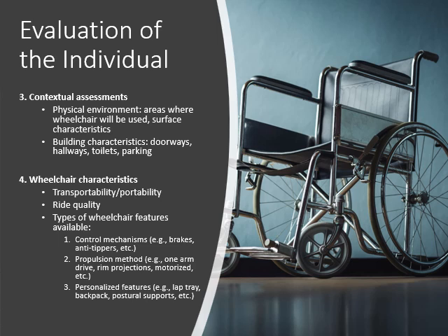How is the patient going to propel themselves? Are they going to use one arm and one leg if they've had a stroke? Or are they going to be using both upper extremities? Do the rims of the rear wheels need special projections to help them propel themselves? Do they need a motorized propulsion method? And then what other personalized features does this wheelchair need to include? For example, a lap tray, a backpack, any postural supports, a headrest, etc.